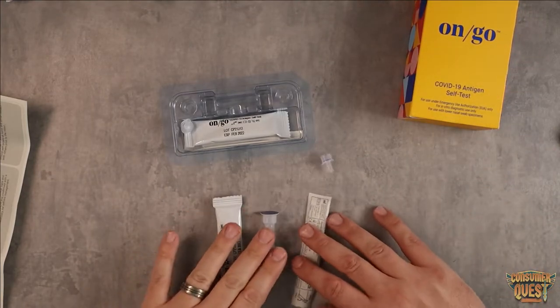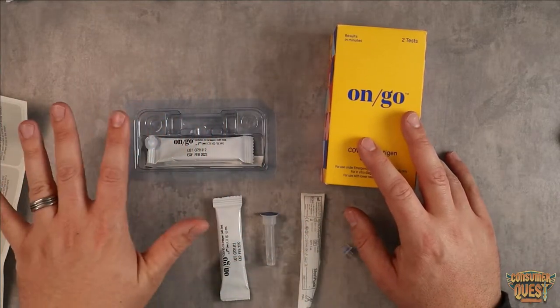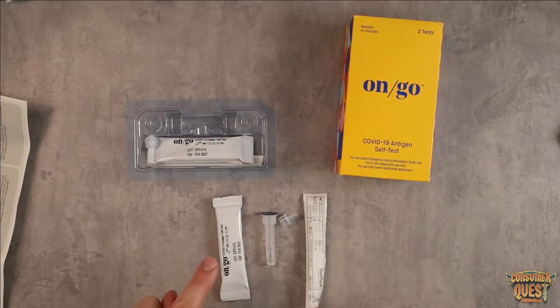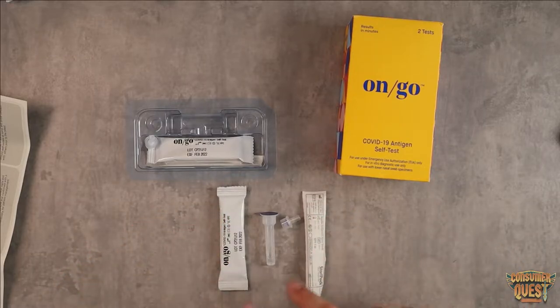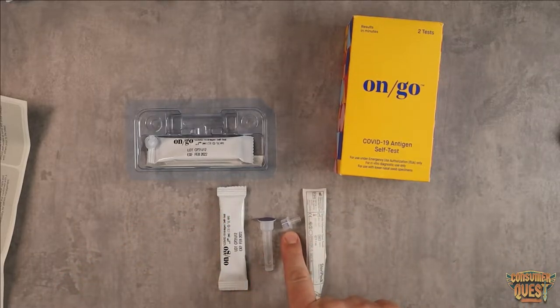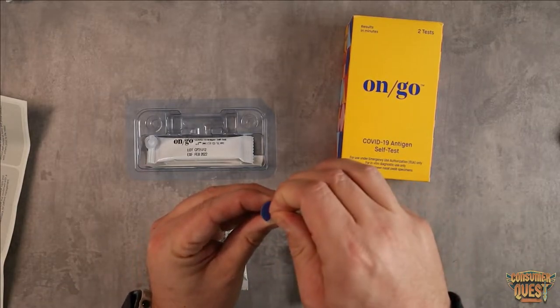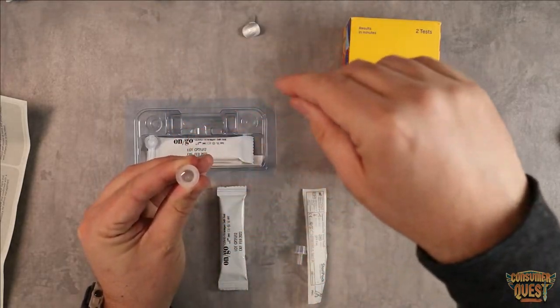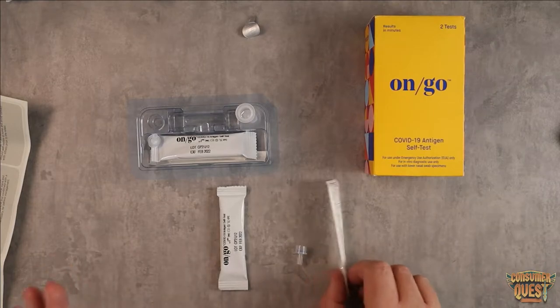First things first, we want to make sure we have everything. In the box you do get two tests — I'm leaving the whole set where they are. You need to get out the actual testing strip, the nose swabs, your fluid pack, and your fluid cap. Start by peeling the cap off the fluid and placing the fluid down in the holder. Now we're prepared to begin the test.